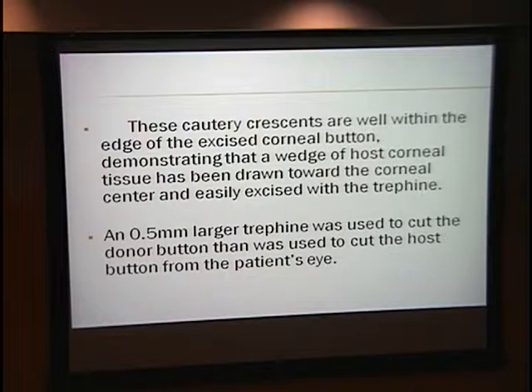An oversized graft is not necessarily a problem, and that doesn't factor in on the astigmatism factor. One doesn't want to use a smaller donor button than the size of the hole on the recipient eye. That has happened in the history of ophthalmology, and it was not good for him at all. It was a big problem.